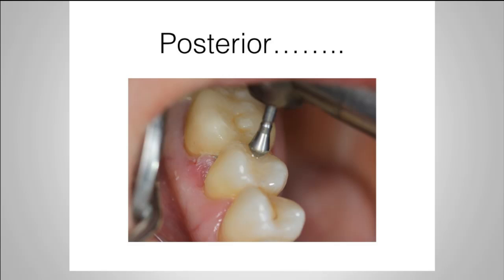These are some of the burrs that I want to show you. These are some of the polishing points that I use, in terms of the beginning of my process. This is a Raptor burr by Kerr in one of their logic sets. And the nice thing about Kerr is they've set up some logic sets in the sense that you can buy little blocks of burrs that cover the gamut in terms of how you want to handle your composites, whether you're one that likes to put in anatomy with the use of a burr, or even if you just want to use a finishing kit right away, you've done most of your sculpting with hand instruments, whatever it is. There are some nice logic sets.